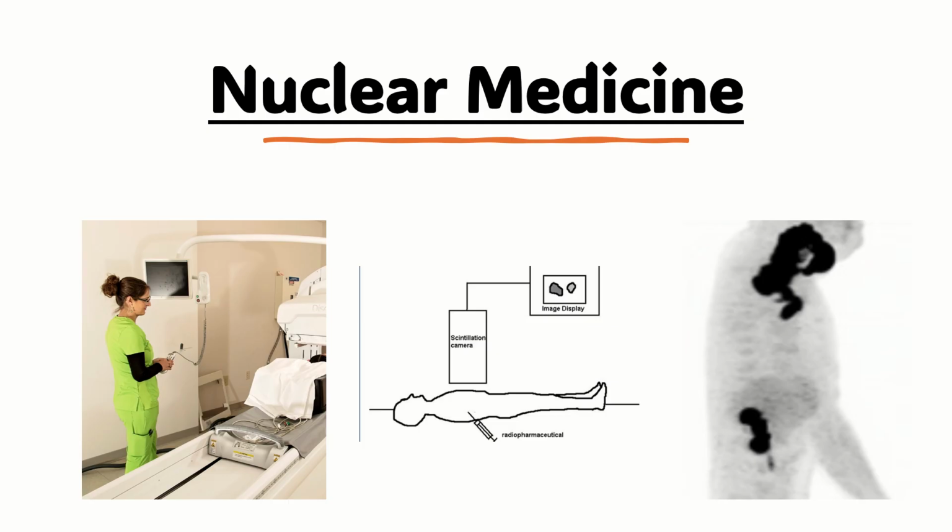In the middle image, it's showing that a radiopharmaceutical has been injected into the patient's vein. You can also see the scintillation camera above the patient. That detects the radiation emitted from inside the body and transmits that data to an image display system.